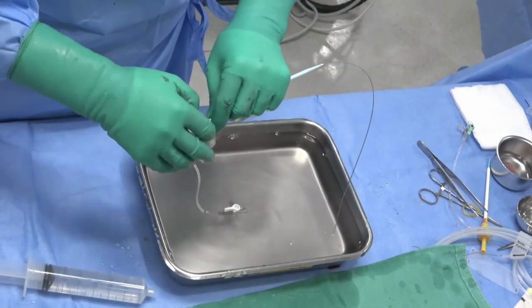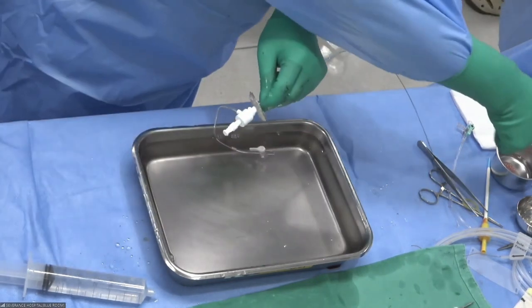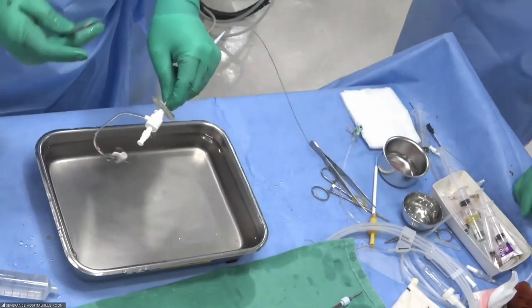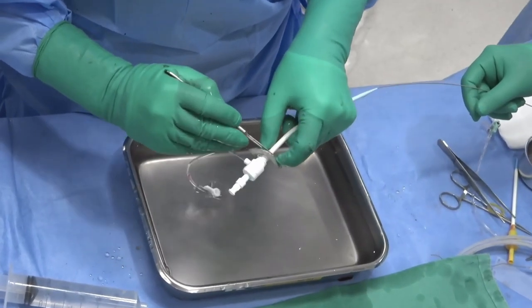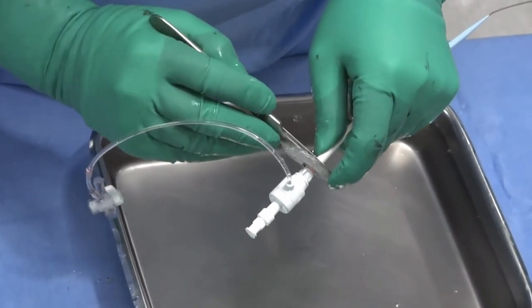So you see the device now? Yeah, we see it. What size did you use? 26. It may be a time-consuming procedure, but I would like to move to 26 first. And then if it is still too small, I'm going to move to 28.